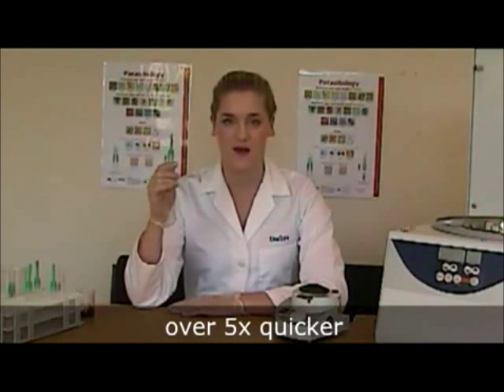The processing time of the Paracep is over five times quicker than any other form of concentration. It is placed directly into the centrifuge, which frees up lab bench space, and needs only two minutes at 500 Gs.